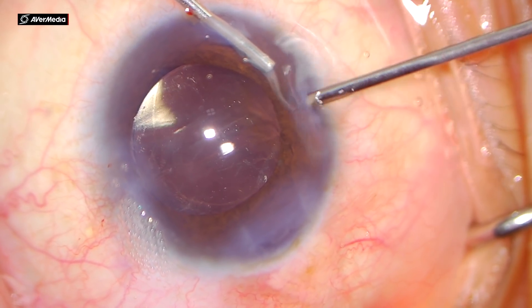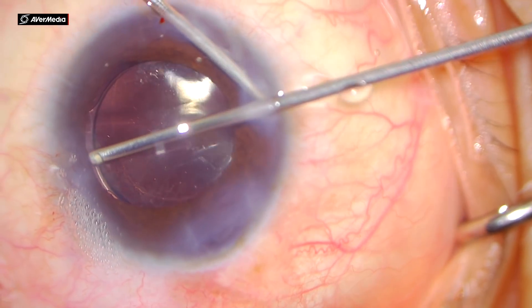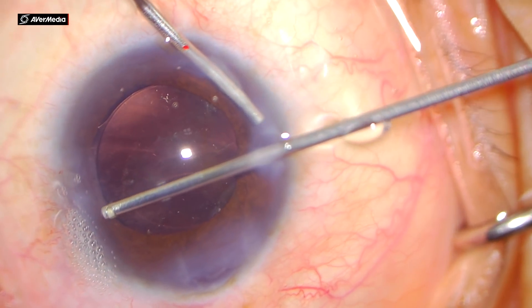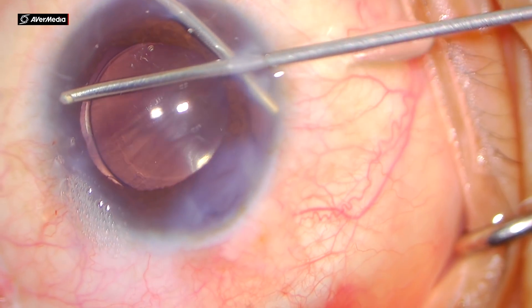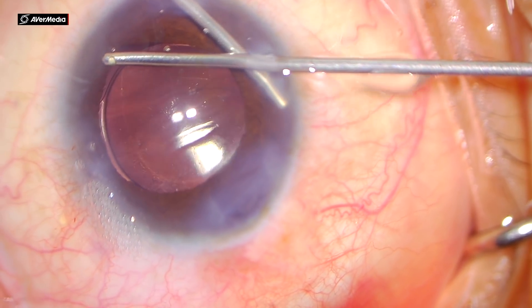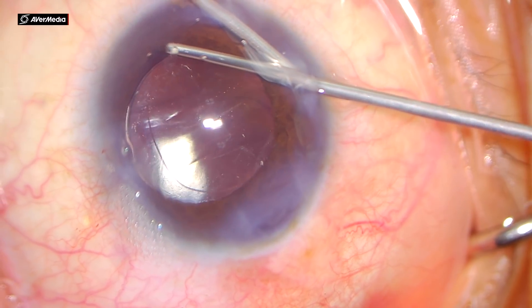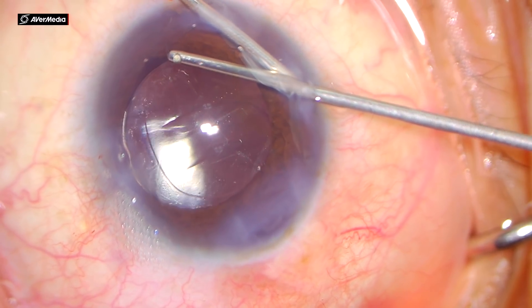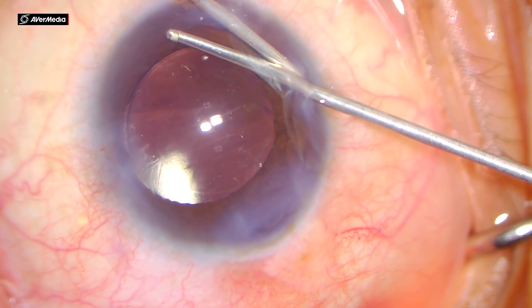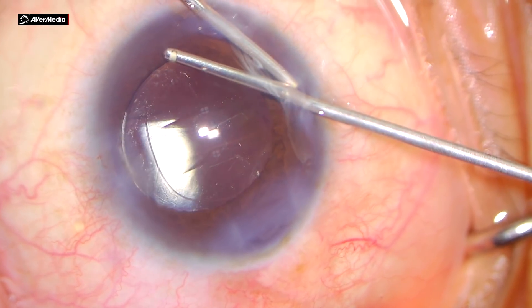With my irrigation cannula inside, I used the cutter to cut any vitreous remaining in the ports. Back into the anterior chamber, the direction of my cutter is up and I moved closer to the port so that any vitreous strand passing from the vitreous cavity through the port to outside would be cut. The vitrectomy was almost completed.